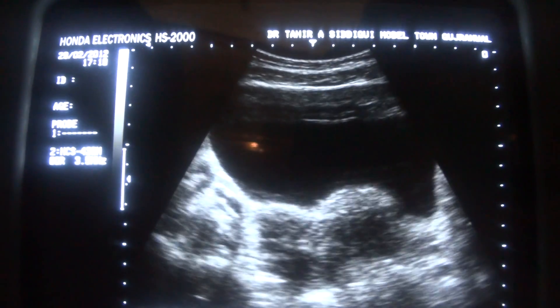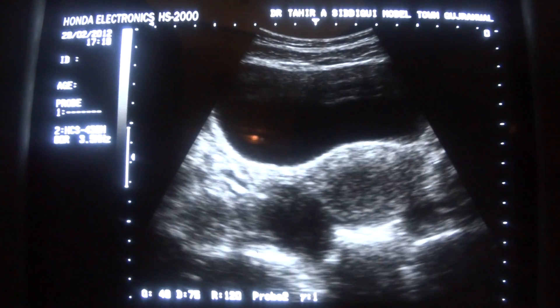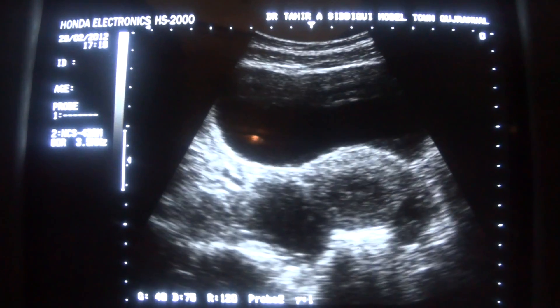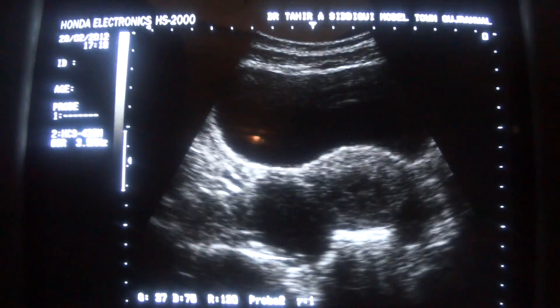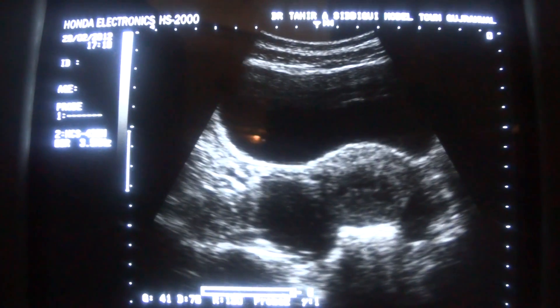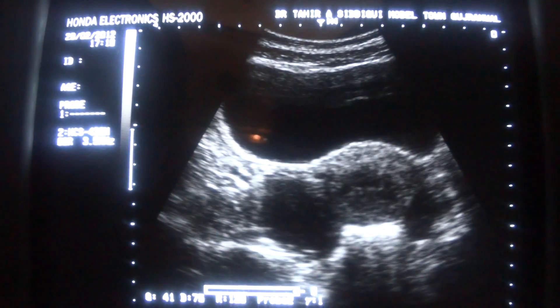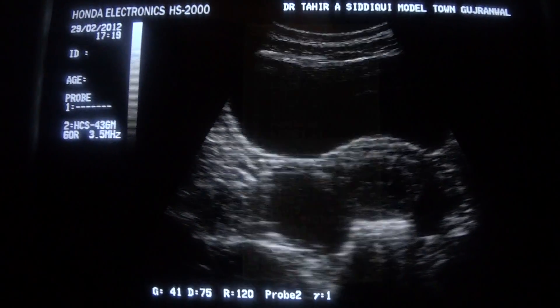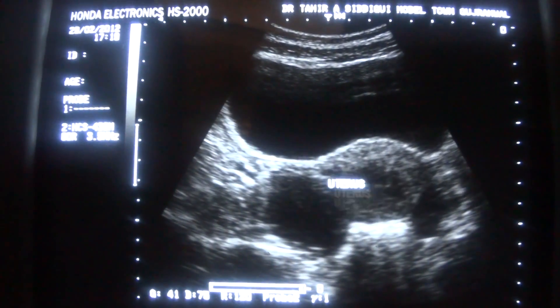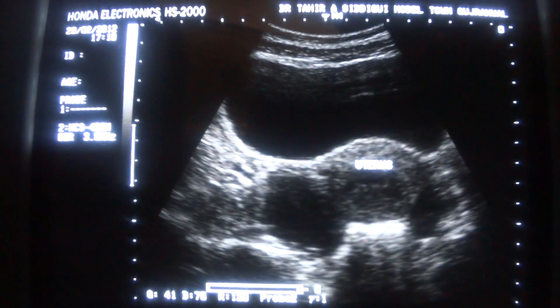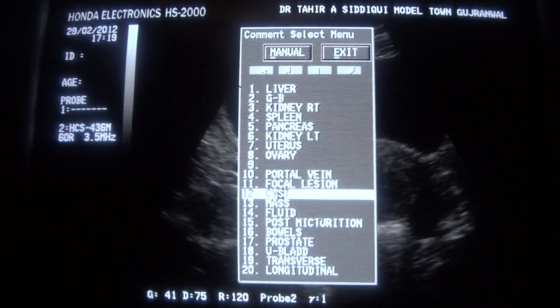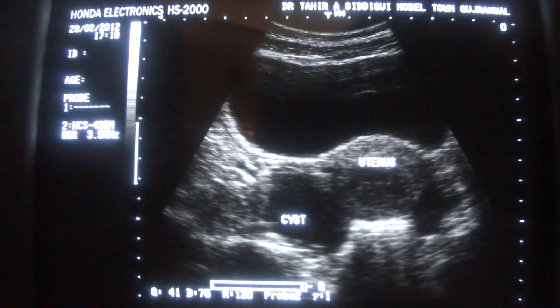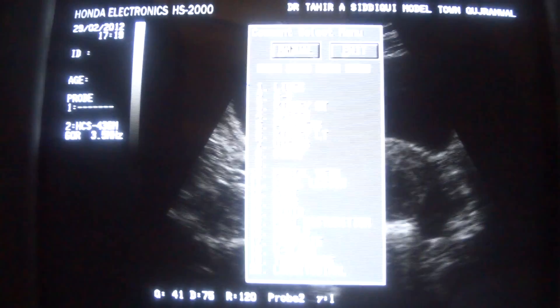Now, in the right adnexa, this is the transverse section of the uterus. This is a small cyst in the region of the right adnexa, which is ovarian.